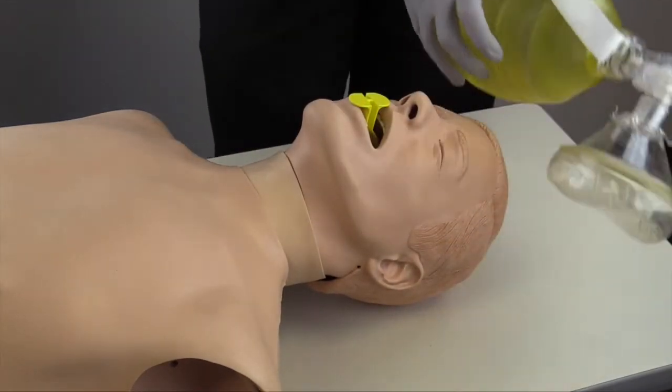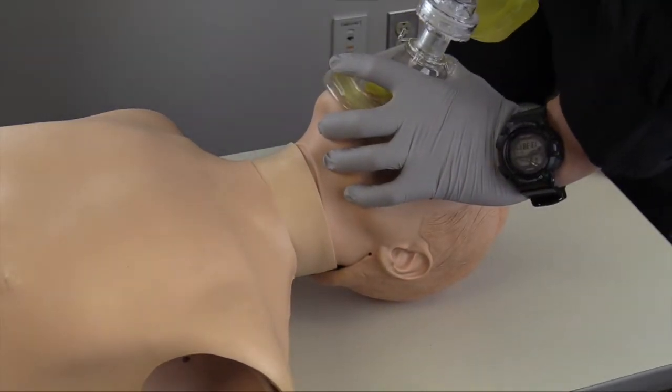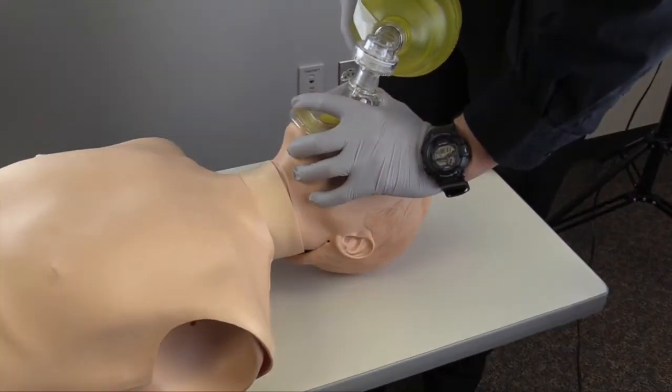I will then begin manual ventilations with a bag valve mask. I will make sure I am providing proper ventilations, looking for good chest rise and fall, and then attach my bag valve mask to oxygen at 15 liters per minute. I will ventilate at a rate of one breath every five to six seconds while watching for chest rise and fall.